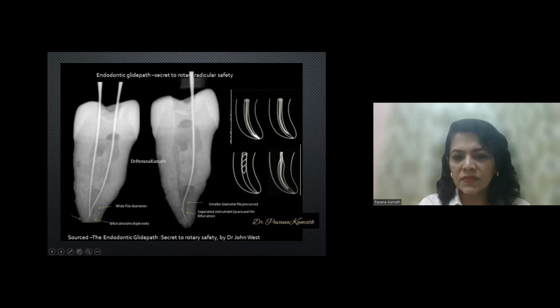One more thing that we can see now, if we observe closely, the apical third displays an anatomy where there is a bifurcation or a trifurcation. And when the files were pre-curved in a certain way, their incidence has been towards the canal, which is located towards the left. And when the file was pre-curved differently, it has shown tendency to negotiate the canal, which is more towards the right. So that is the role and benefit of pre-curving an endodontic file while negotiating the canal to the apical terminus. To the right, we can see a few images.